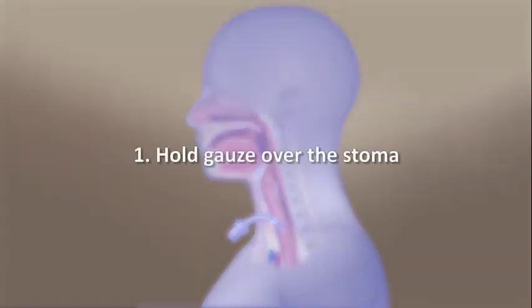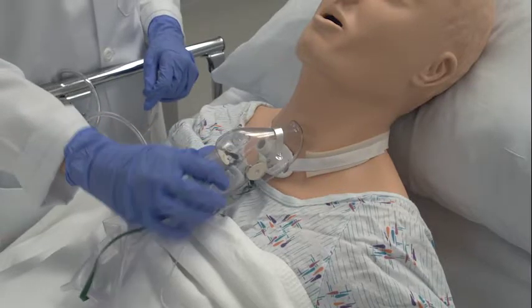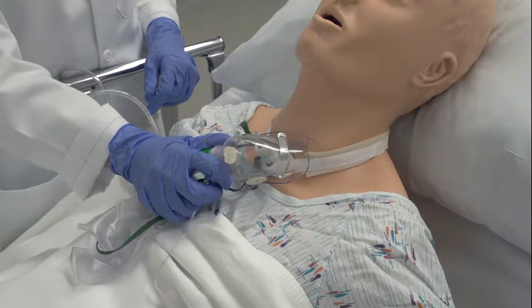First, hold a sterile 4x4 gauze or other object over the stoma while you ventilate over the nose and mouth with a resuscitator bag and mask. It may be necessary to have another healthcare provider assist with this, as it can be difficult to coordinate by yourself. If the native airway is not appropriate for bag or mask ventilation, such as the case with a patient who has suffered severe facial trauma, you may place the mask over the stoma site and attempt to ventilate through the stoma.